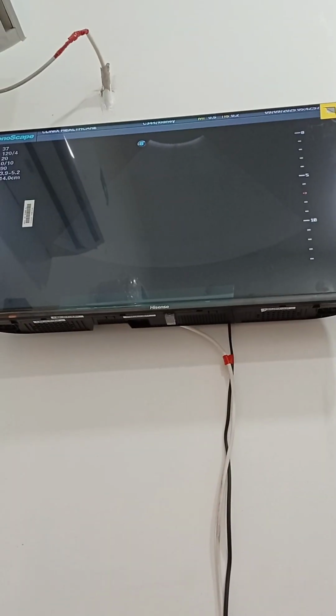Ultrasound medicine is in knobology. The knobology is the language of the sonologist or the sonographer. Here you have to know everything about the buttons you press and what they do. Without the knobology, no matter how good your diagnosis is, you cannot make a good image or even help your patient or the clinician. For advanced learning, we have to go into some other knobs.